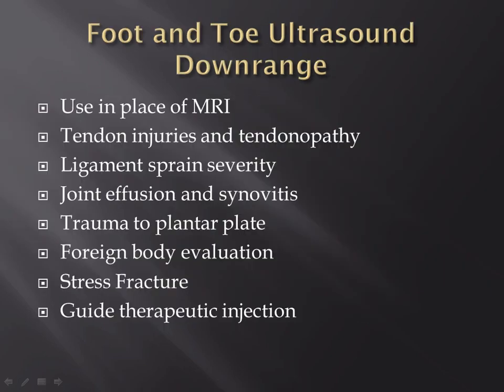So this is a topic that maybe at some point we should condense everything from these 2 days for those of us who are military radiologists, because there will be a time where we're downrange and ultrasound may be our only additional modality as opposed to plain films. How could this help us if we're deployed? A lot of things we can see on ultrasound that we're used to looking at on MRI, such as tendons, ligaments, Morton's neuroma, potentially stress fractures, and certainly foreign body evaluation, and you've got the ability to guide therapeutic injection.